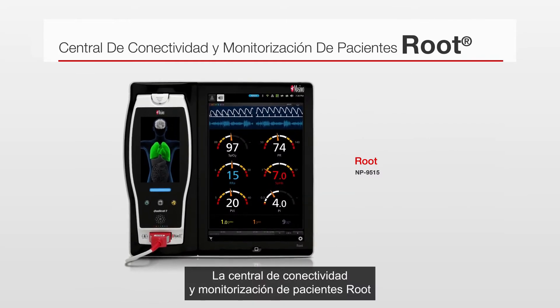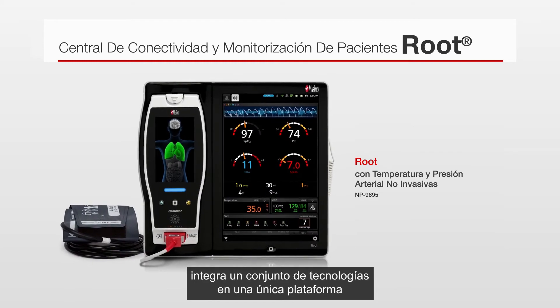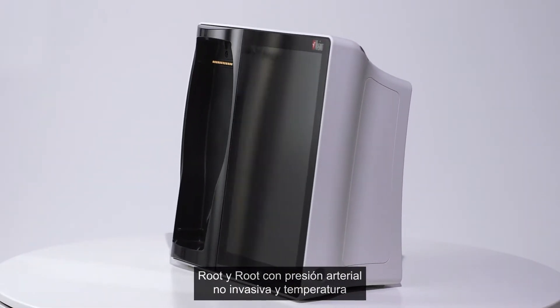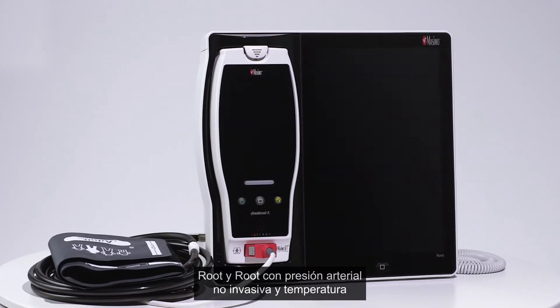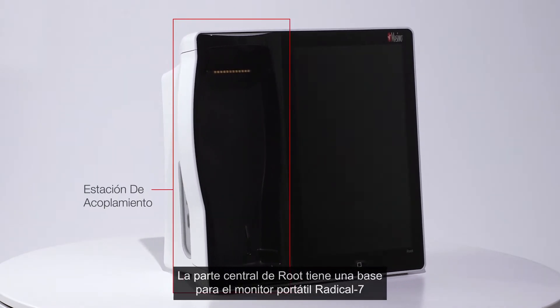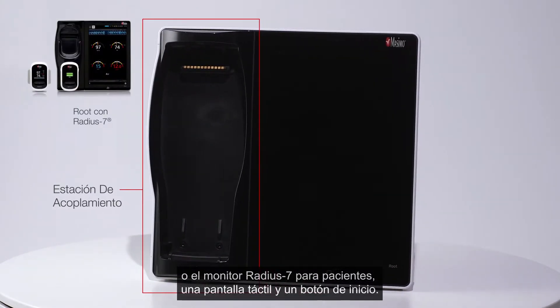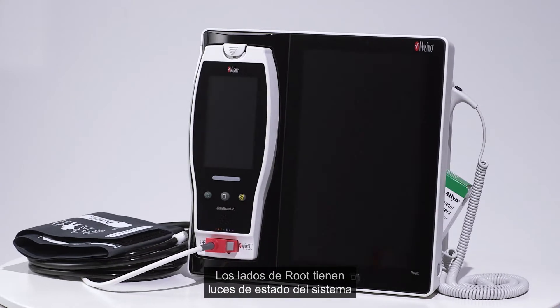The Root patient monitoring and connectivity hub integrates an array of technologies into a single platform and is available in two configurations: Root and Root with non-invasive blood pressure and temperature. The front of Root includes a dock for the Radical 7 handheld monitor or Radius 7 patient worn monitor, a touch screen display, and a home button.